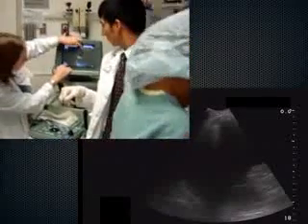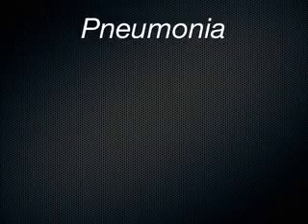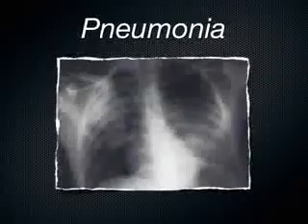This is not used as commonly in the ICU, but it's becoming more popular. Like I said, the European groups, Lichtenstein and so forth, use ultrasound almost exclusively to diagnose consolidation, and chest X-ray is less popular. So pneumonia on a chest X-ray looks like patchy, multilobar infiltrates. You don't know what the infiltrates are. You can't say it's infection. It could be blood, contusion, tumor, but you have an infiltrate.